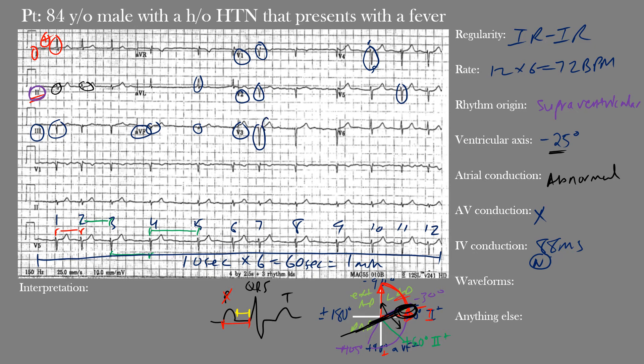Remember: the Q wave is the first negative deflection before the R wave in the QRS complex, and the S wave is the first negative deflection after the R wave. The T waves appear present, asymmetric, and normal. Without a P wave we can't comment on the PR segment or PR interval. QRS amplitudes appear within normal limits, the ST segment doesn't appear significantly elevated or depressed, and the QT interval appears within normal limits. The only major waveform abnormalities are the abnormal Q waves in leads III, aVF, V1, V2, and V3.